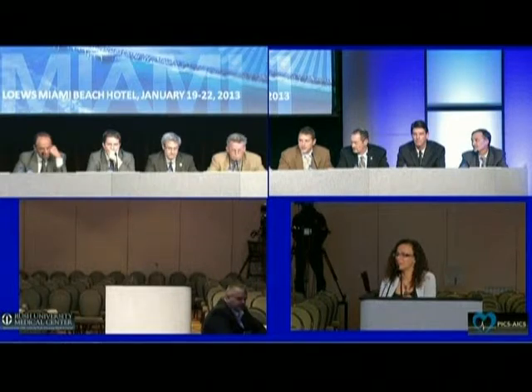Huwaida? Just a question for Evan. You showed that beautiful picture of the LeCompte with the PA and the aorta. Did you do simultaneous injections, or did you do an injection of each one and overlay them? We've only looked at, I suppose you could do it either way, but in the interest of radiation saving, we just do simultaneous injections. So the radiation dose basically remains the same or comparable, so it's one spin, and it's just two injectors injecting at the same time, more or less.